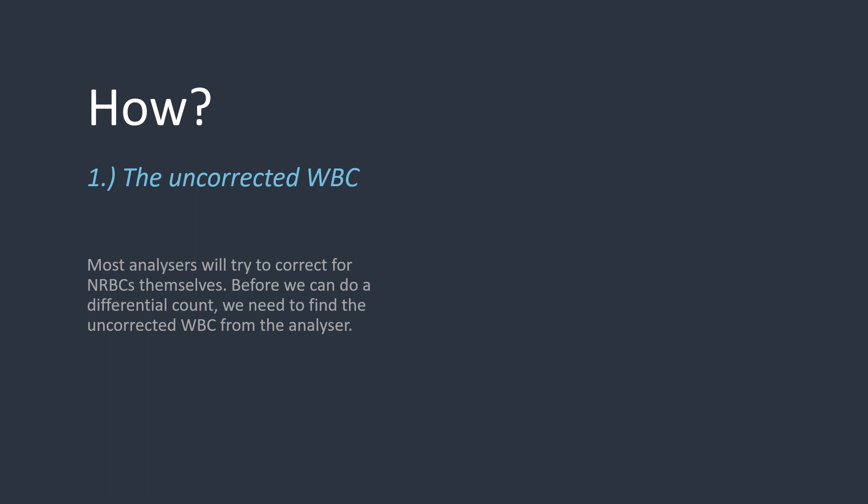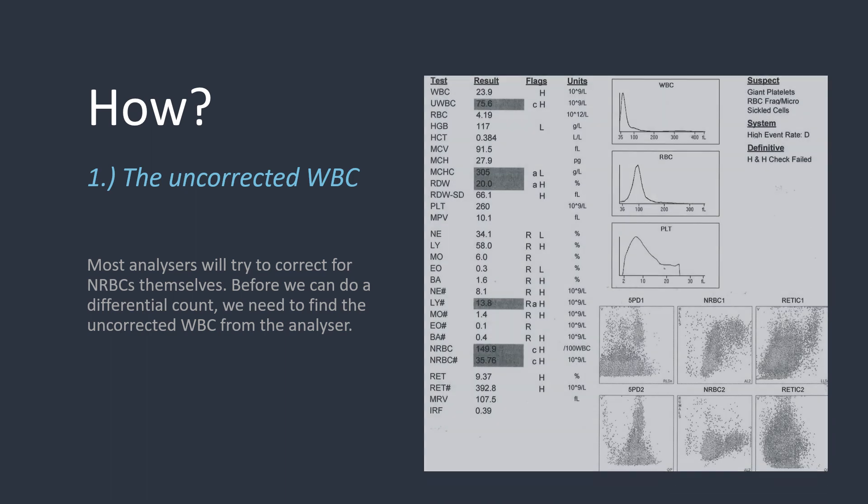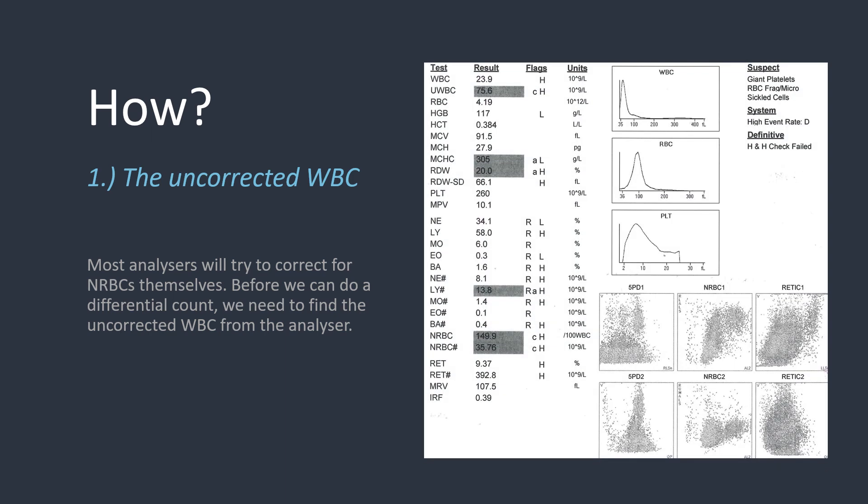Depending on the analyzer being used, the challenge of finding the uncorrected white cell count will vary in difficulty. On the right-hand side, you can see an FBC report from an analyzer. The total white cell count is 23.9, but the uncorrected count just below it is 75.6. So I'd go in the record, remove 23.9 from the white cell count, and replace it with 75.6. And that is step 1 complete.